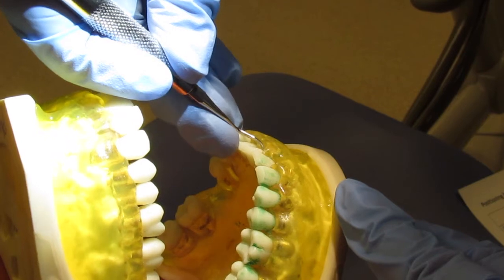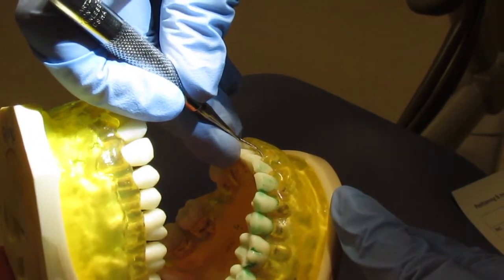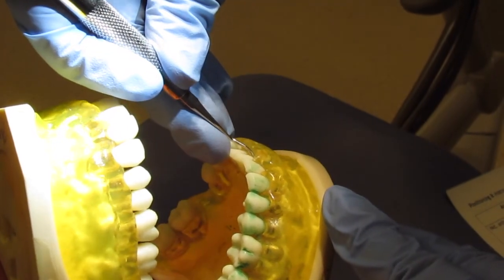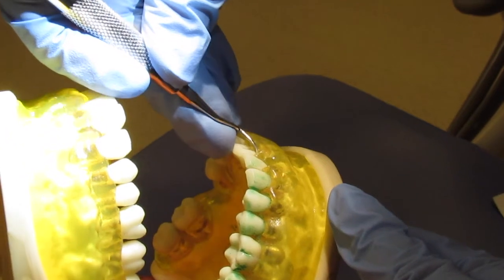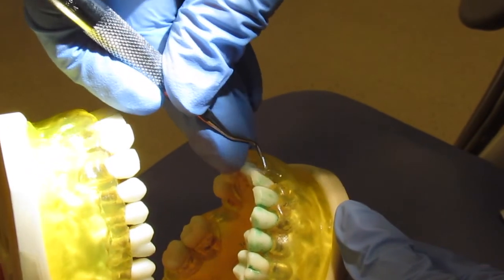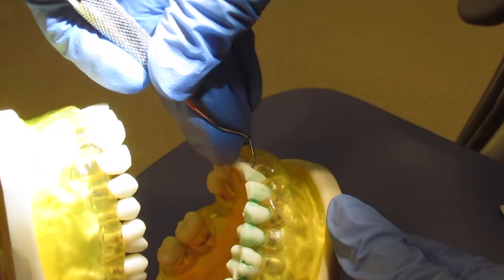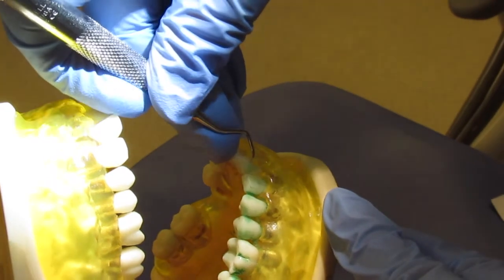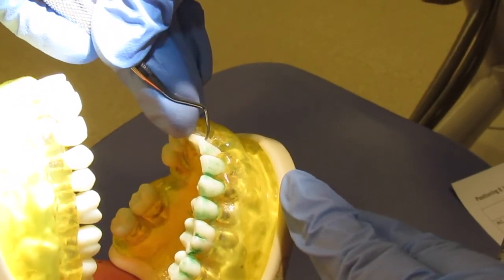We're going to do the universal curette in the anterior. I'm going to do surfaces toward me. So you start in the middle of the tooth, put the leading third against the tooth surface, and initiate little sideways rocking strokes. As you're rocking back and forth, you're going to be pivoting and rolling so you keep the leading third adapted against the tooth. You go halfway and then you stop.